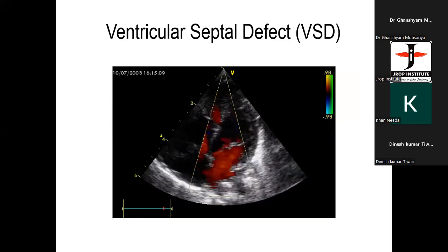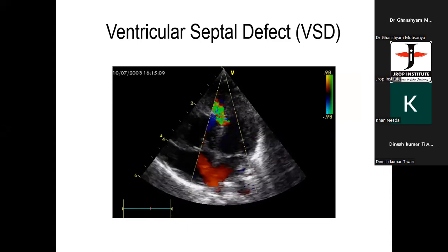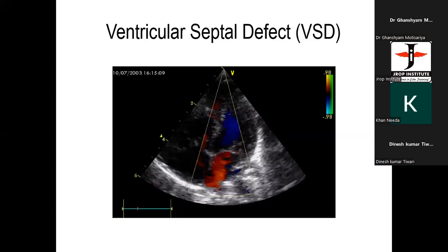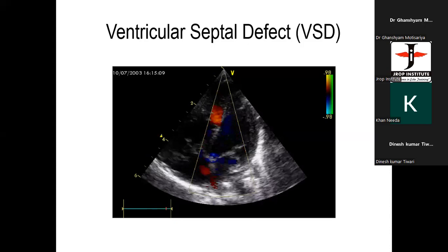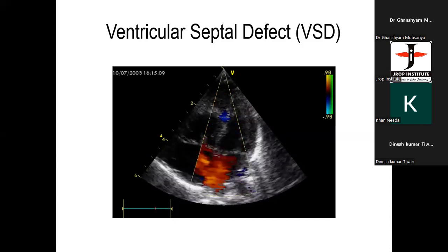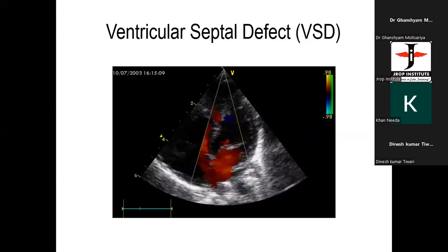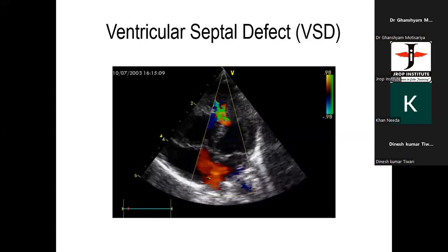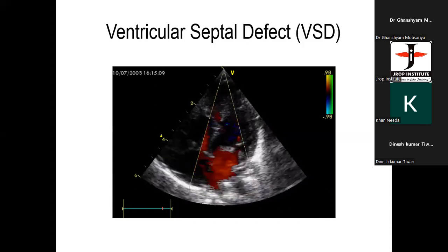Yes, sir. Agitated saline is a good option, but even with color Doppler, many a time the pulmonary vein flow or the SVC flow comes, which mimics flow coming from the LA side or RA side going to the LA side. Okay, fine. If such a dropout is present and RV, RA are normal size, the ASD is unlikely. And you can go and prove in the subcostal window whether there is a defect in the interatrial septum or not. RA-RV dilatation is a... Right, correct. Okay, sir. Thanks, sir.